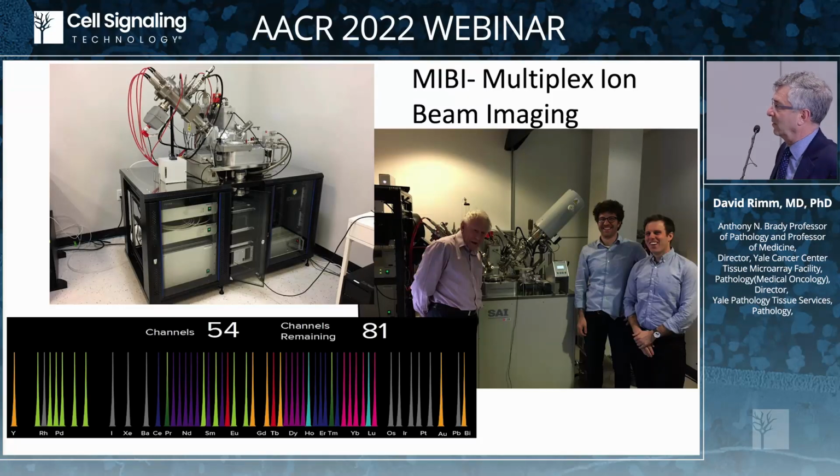Mike Angelo here and Harris, I'm blocking on his name. And this was the beta unit that they used, although I'm sure there's a lot more going on now with MIBI. The advantage of this technology is that you can multiplex up to 50 channels or so, although I think most of them are in the 30 to 50 range, without having the spectral overlap that you see with fluorescence.